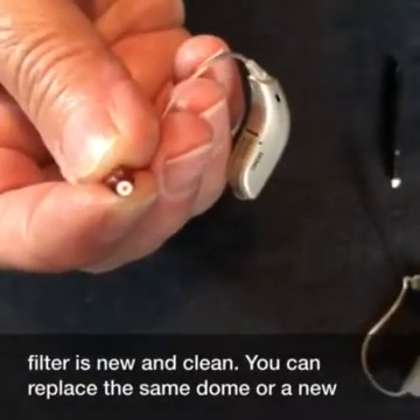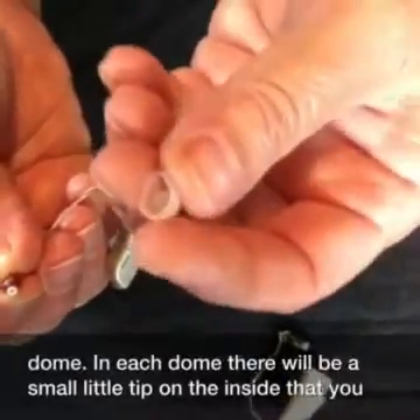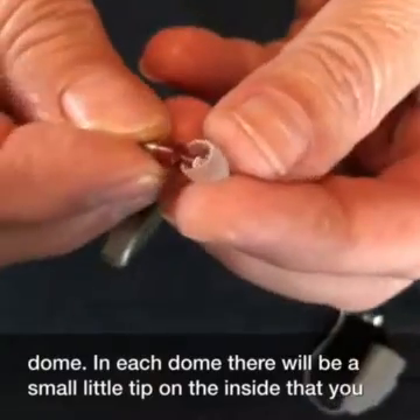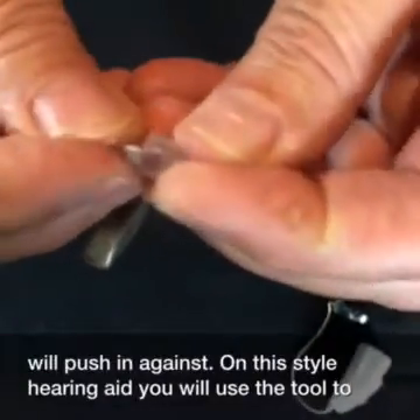You can replace the same dome or a new dome. In each dome, there will be a small little tip on the inside that you will push in against.